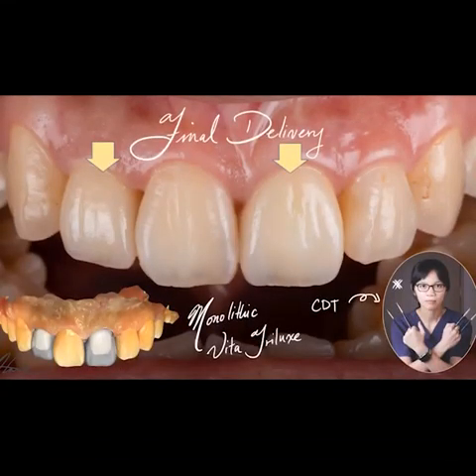So the next time you see a one-visit CAD/CAM case like this one I posted a month ago, see if you can spot the extrinsic changes that Sally here has made. It's something that once you start to notice, you can't really unsee it anymore, but even if it loses a little bit of the magic, I think we can all end up appreciating the aesthetics even more.